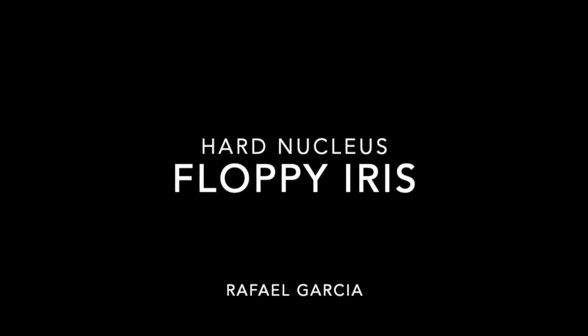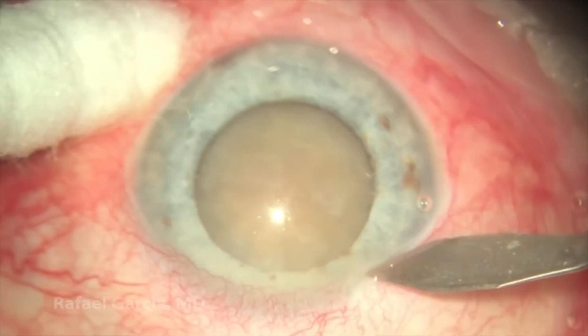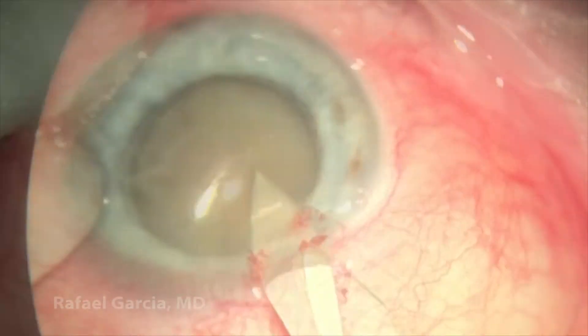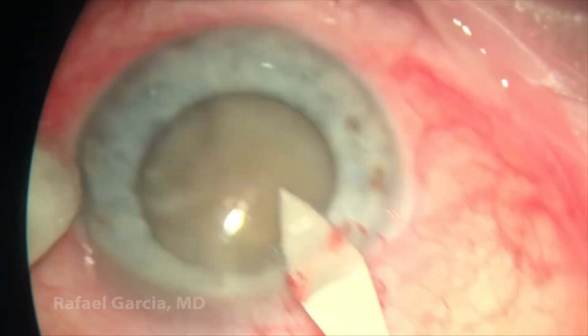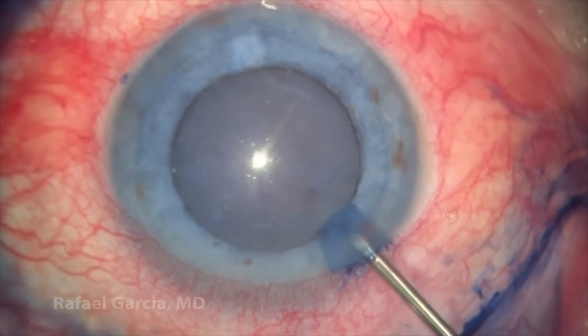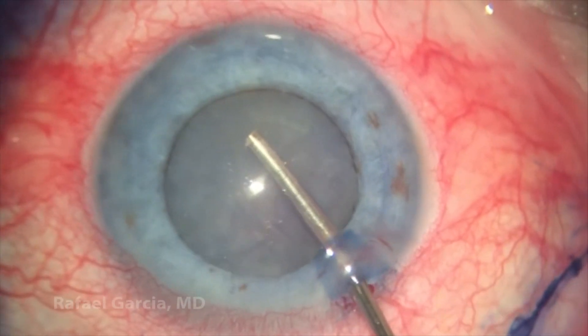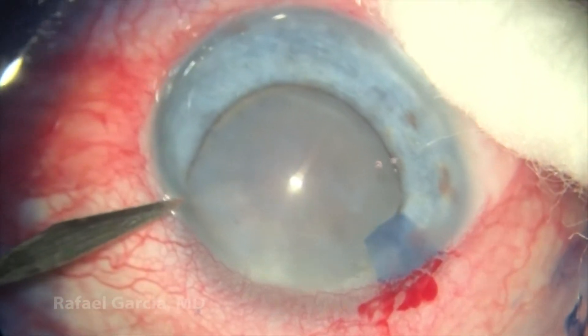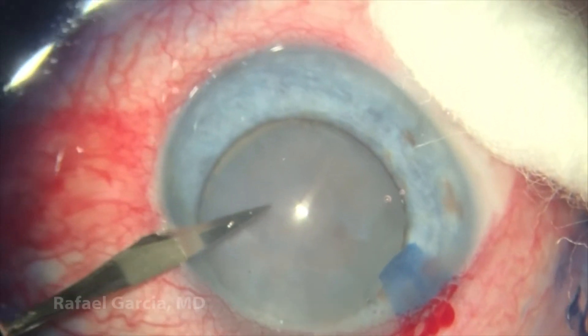This is a male patient with a hard cataract who was under the use of Tamsulosin, a medication known to cause floppy iris syndrome. We begin this case by making a triplanar corneal incision, then some trypan blue dye is injected and a cohesive viscoelastic is used to inflate the anterior chamber and prepare for the capsulorhexis. This patient is under retrobulbar anesthesia.